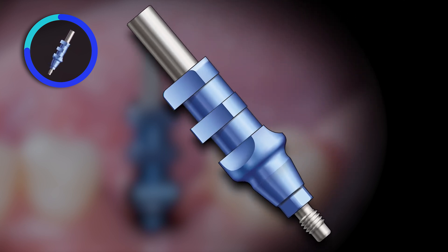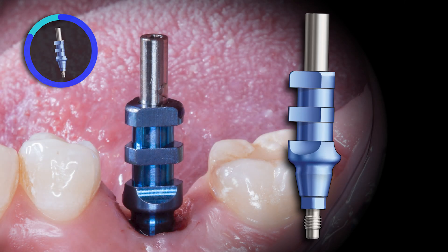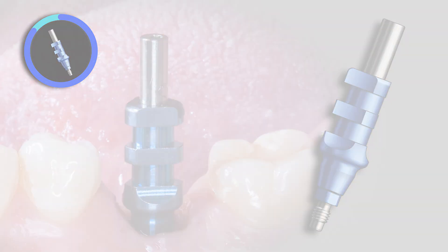As you can see, these copings are taller than the closed tray copings. Make sure your patient can open wide enough to be able to place and remove this style coping.